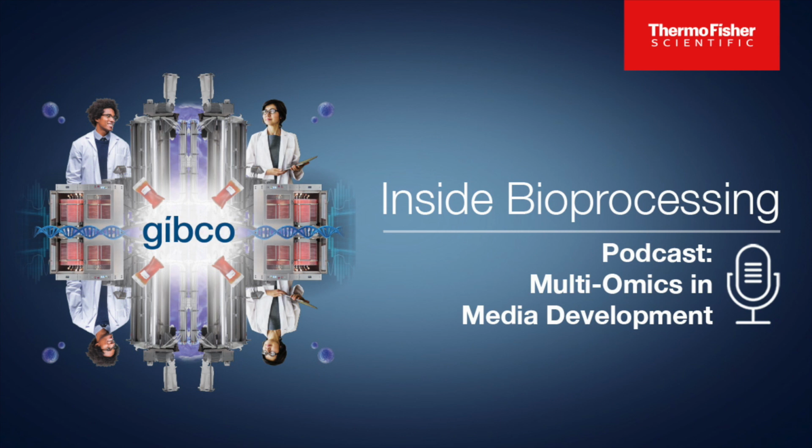For spent media analysis, how long has this been the industry standard for media optimization? How exactly does it work, and what would you say are some of its limitations? Sure. In terms of spent media analysis, I would say it's been the industry standard at least for the last 3 decades. Really taking hold in the 90s is when industry started looking in depth at what was occurring inside the medium. Up until that point, a lot of work was done around basically dose curves where we knew certain metabolites were needed, right? All cells need methionine, so you can do a dose curve to determine how much methionine to add to the formulation, and that dose response would give you a basic understanding of what to put into the formulation.